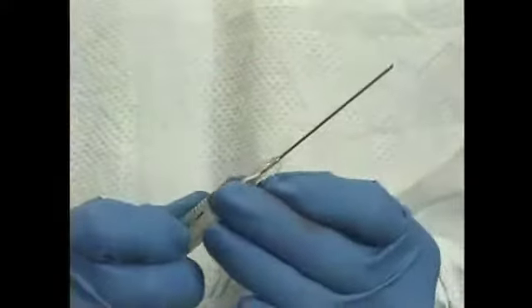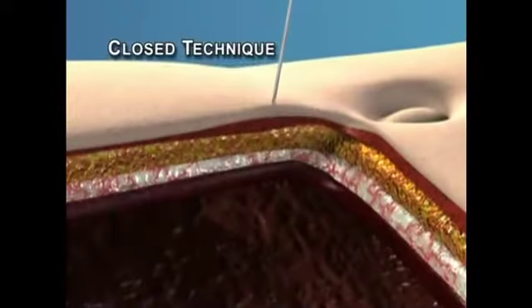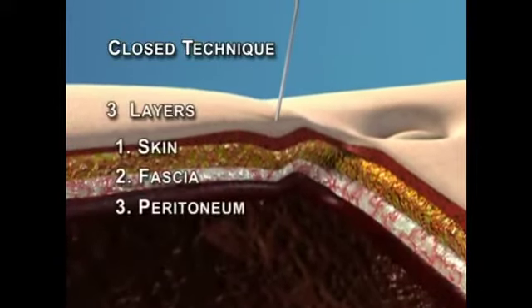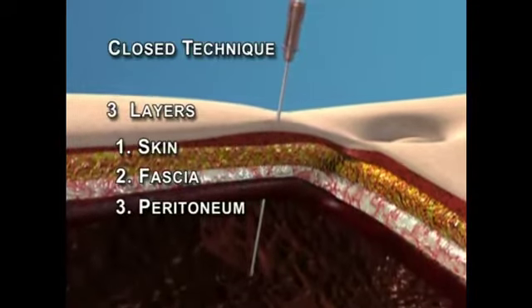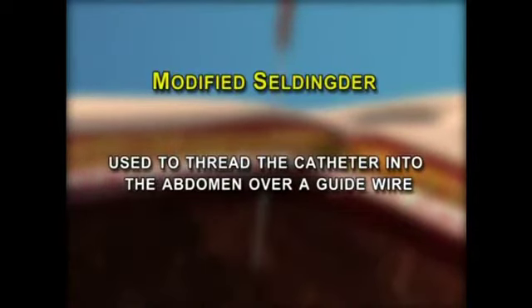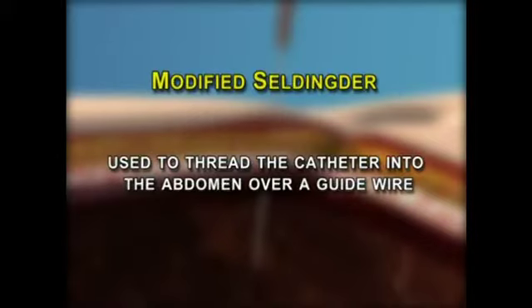Note: the closed technique uses an introducer needle to penetrate the three layers of skin, fascia, and the peritoneum. The modified Seldinger technique is then used to thread the catheter into the abdomen over the guide wire.